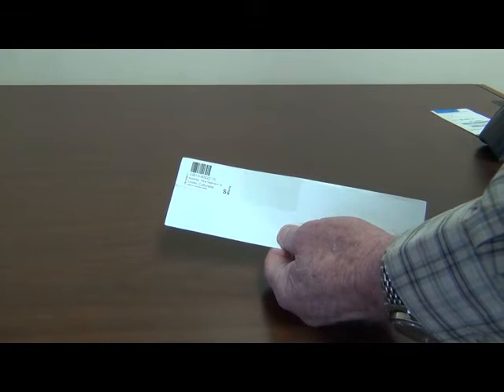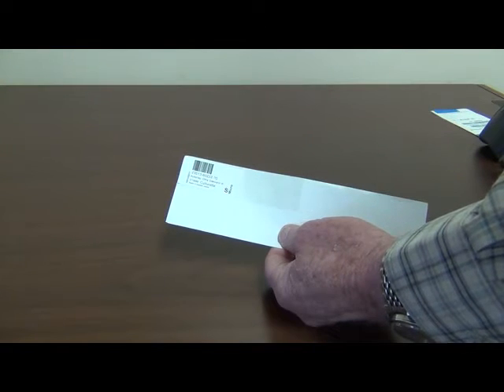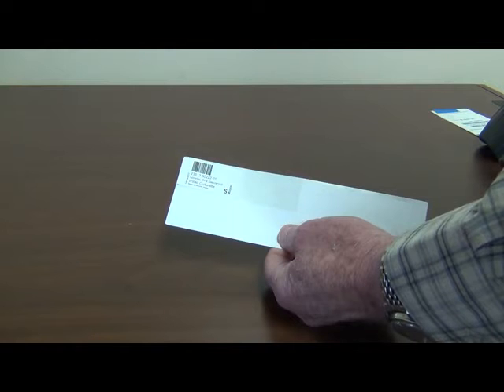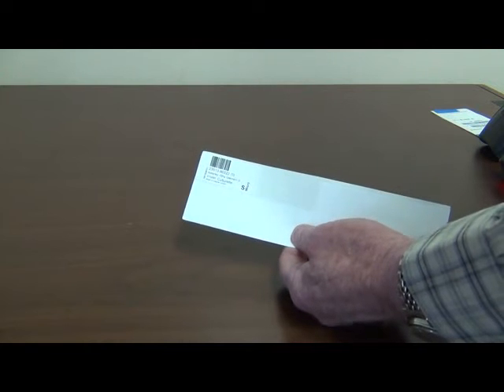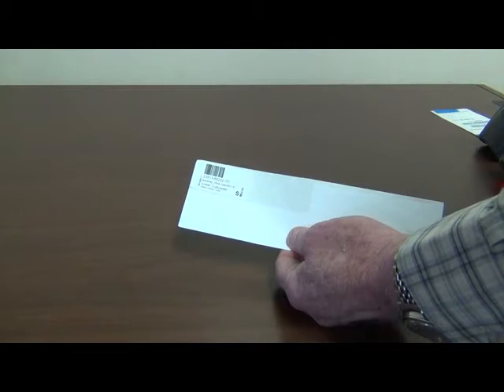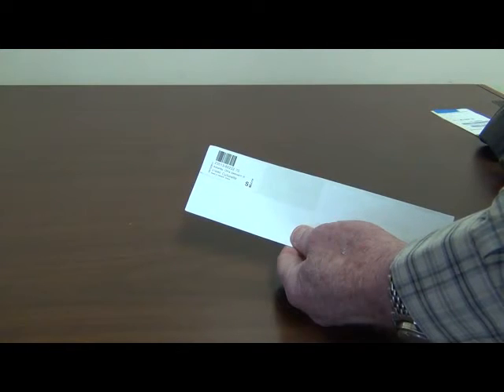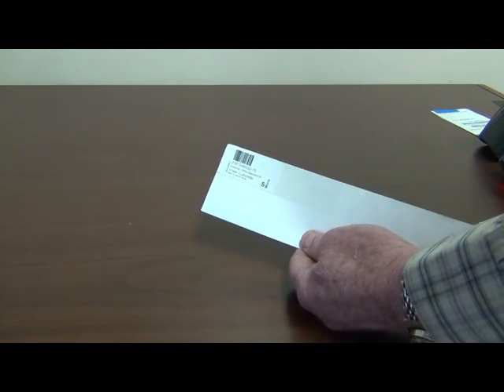So how do you tell? Like we just said, if it's slow to scan or difficult to scan or not able to be scanned, or in the worst case, if it generates the wrong information, all of which happen, then it's time to stop and take a look at it. That is the first thing you do. You take a look at it and examine it by eye. You see if it's really small, if it's been smeared, which would happen in a healthcare environment, if it's been scratched or covered by a film, or creased, or if somebody has accidentally put a grease mark or a check mark on it.